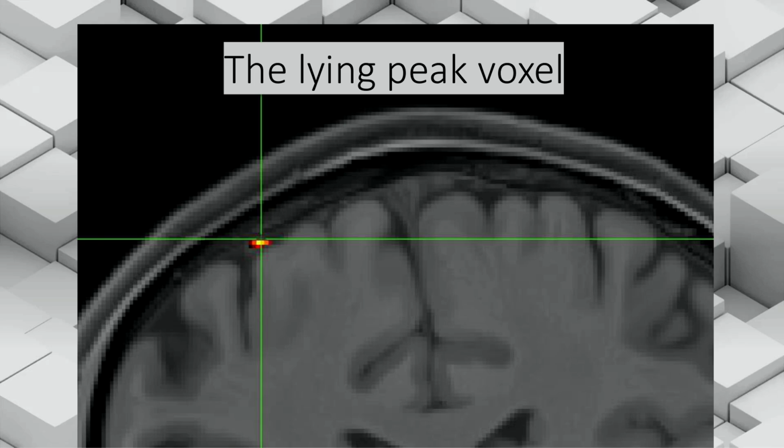of errors. So if you look at your imaging data, instead of just blindly saying, oh, peak connectivity is what I should do, I don't have to look at it, I'll just get the coordinate for it, I'll slap it into BrainSight and go to town on it. It's too easy to get these artifacts, so you should really look at your own data. You should play with the threshold and say, okay, does it follow a brain contour? Is it kind of hanging out in space in a region that you have less confidence in?